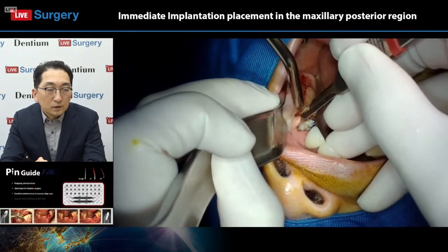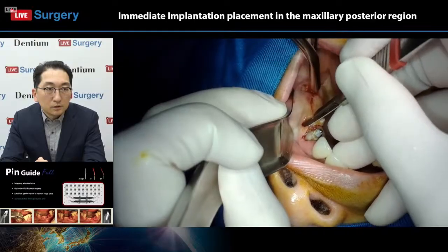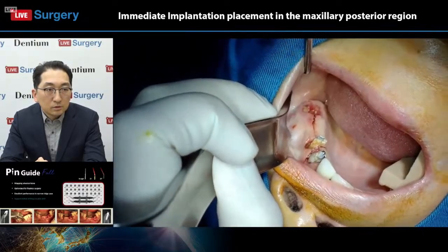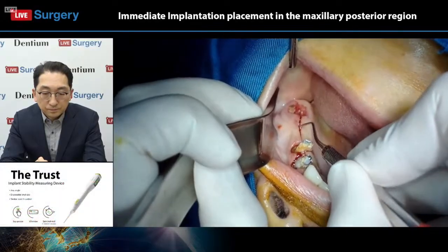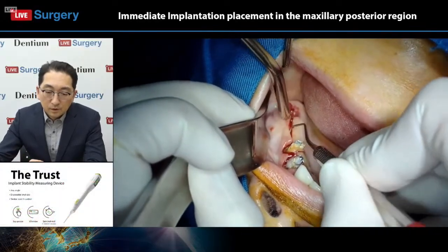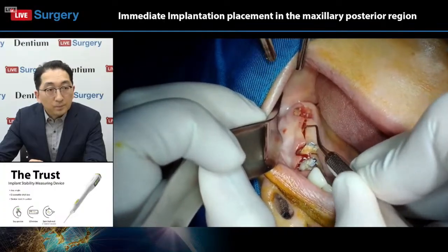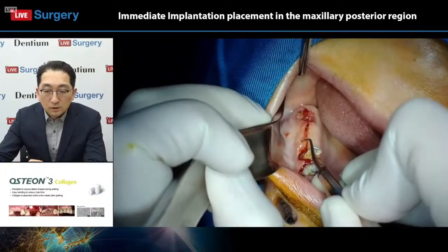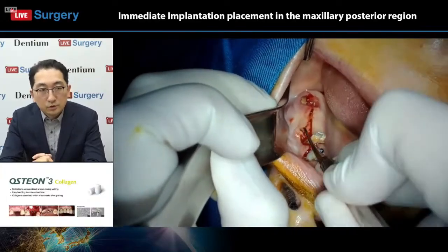After anesthesia, yes. Okay, going incision. When raising the flap, now as you can see, I frequently use a curette.